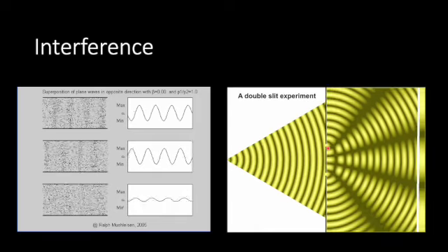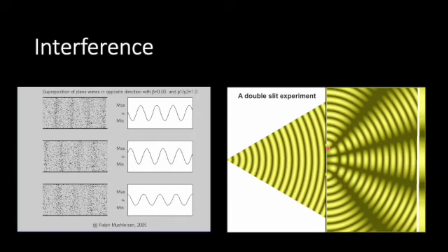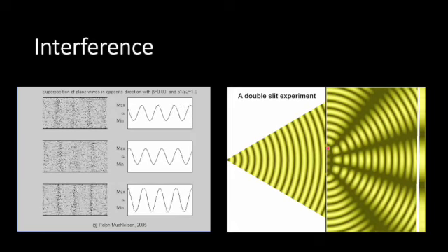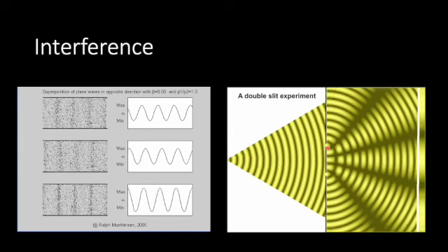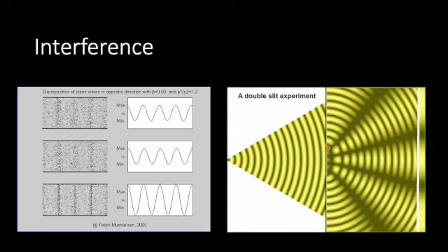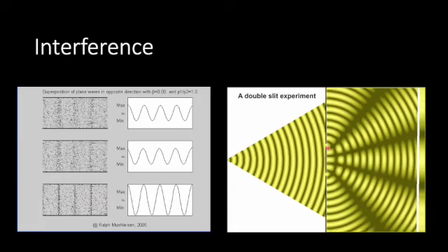Secondly, when there is wave energy that can interact with other waves, the ultrasound machine technology has progressed far enough that usually there's some fancy math that can cancel that out or predict it or help interpret that for us before they generate an image. And so thanks to technology, this is not something that we really have to worry about all that commonly in the human body, but it is important to remember.